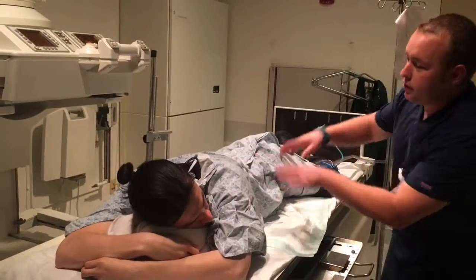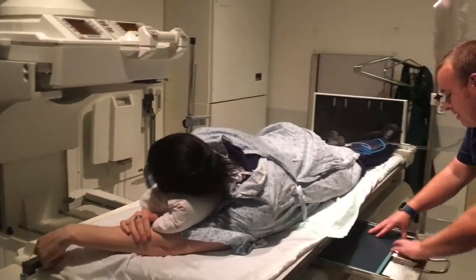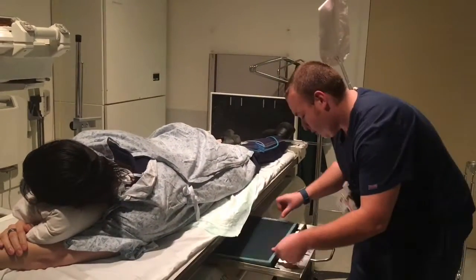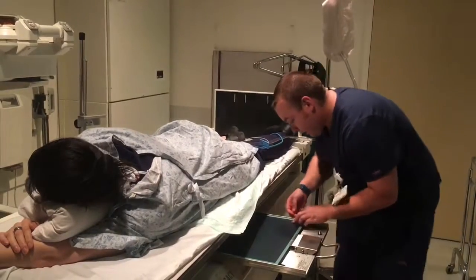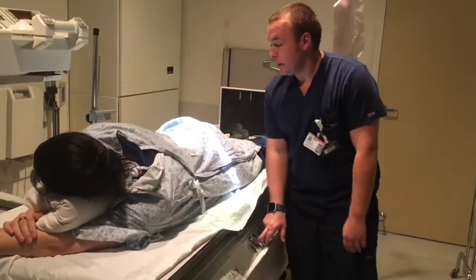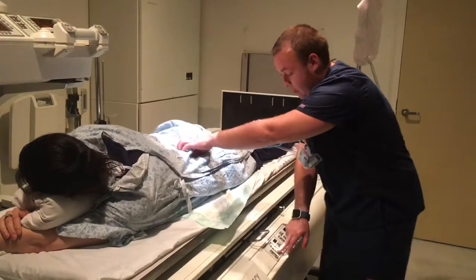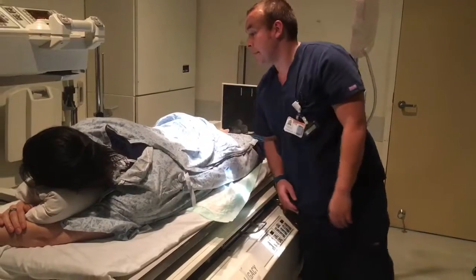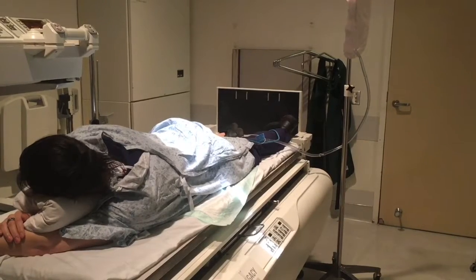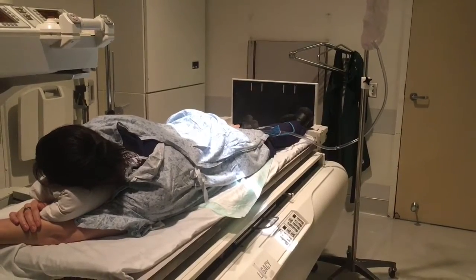Go ahead and same position but opposite side. We're going to do the LAO. Patient's left side still. Only thing I'm going to do different is reposition the patient. Mid-sagittal, iliac crest, 2 inches to the elevated side. That way we don't get any anatomy cut off. Same technique. Looks good. Taking a deep breath. Blow out. Hold. X-ray. Alright, you're doing good.